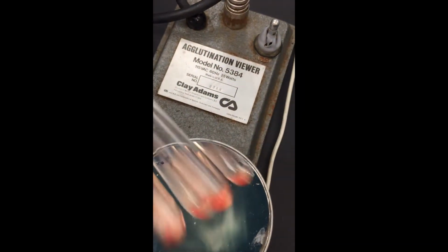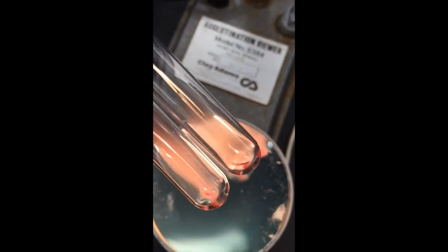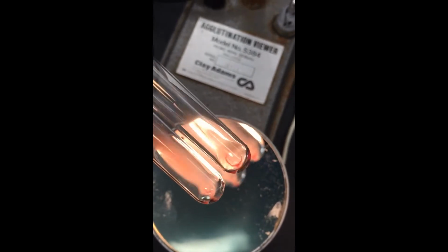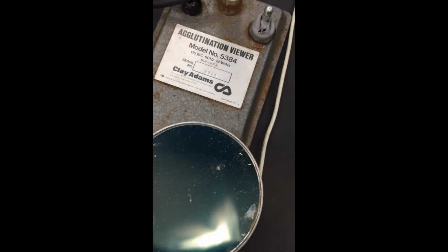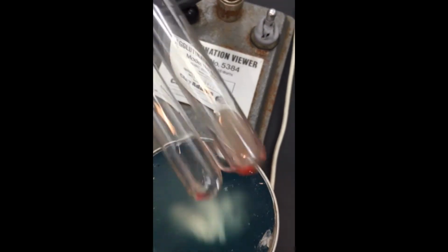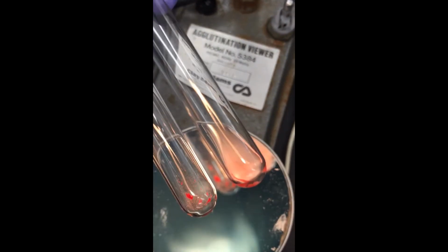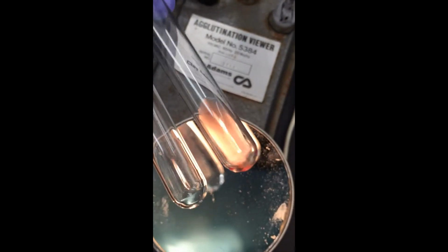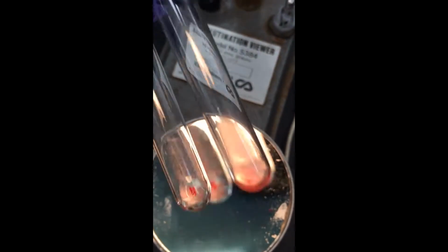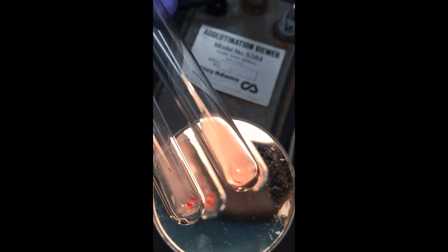This is sample C, immediate spin, tubes 11 and 12. Tube 13 and 14. Tube 13 is on the bottom or the left. Tube 14 is on the top or the right.